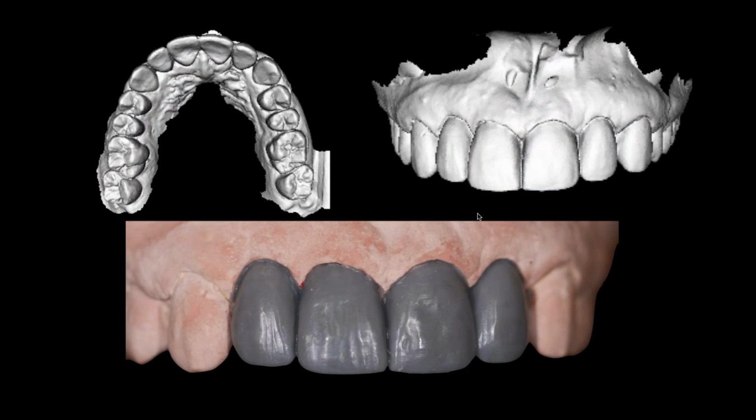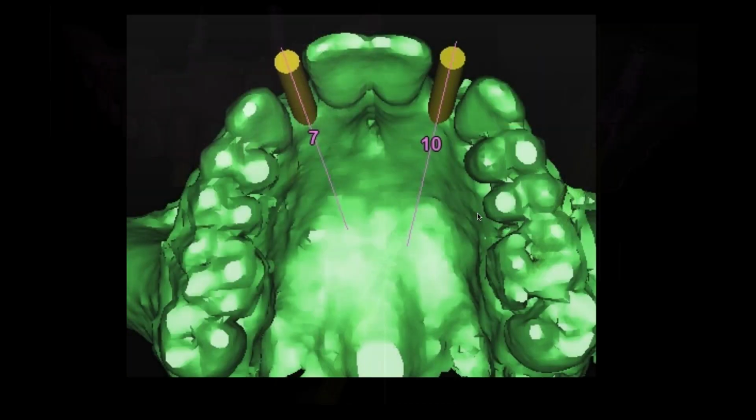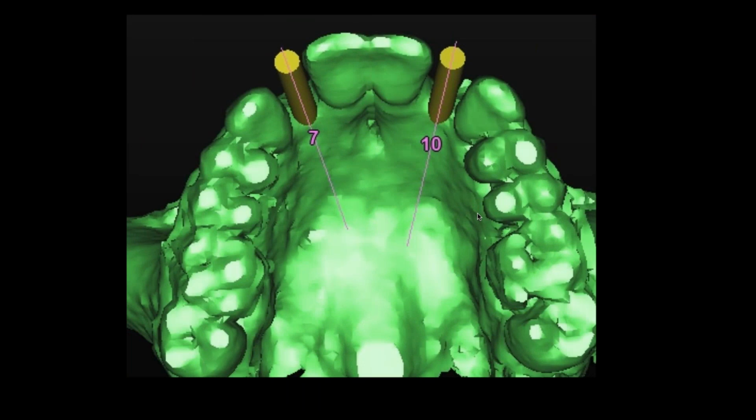And so then I took the setup and I scanned it with the scanner. So now I have a scan of his setup, his model. And then I stitched that on top of the CT scan, and then I put the implants in according to that setup. So now you see them, and you know what? I could superimpose these images. They're exactly the same. And that's what we decided. He was amazed. He loved it. So then we went ahead and put the implants in, as you see here.